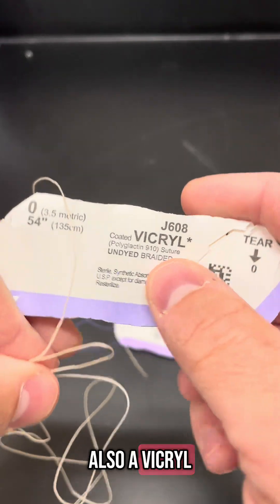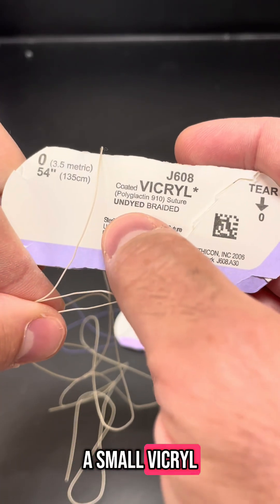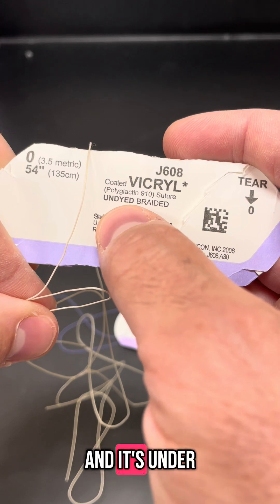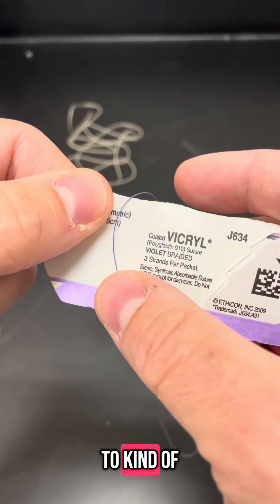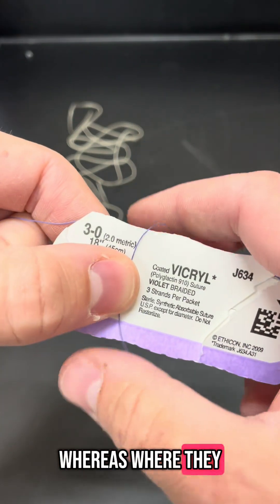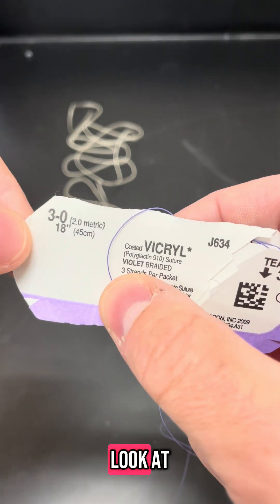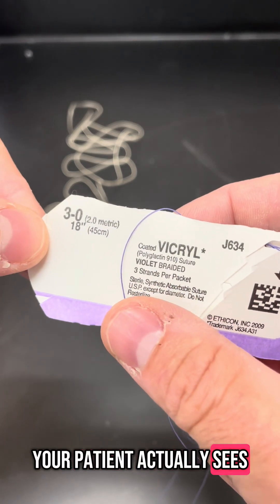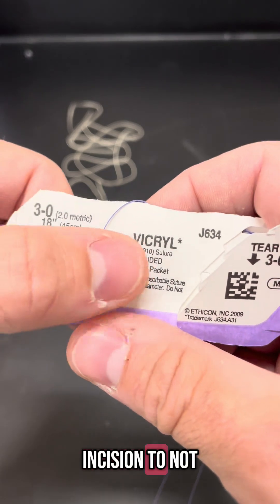Also a vikryl. This one's undyed, so it's white. If you're going to put a small vikryl up under the sub-Q and it's under the skin, you want this to be undyed because you don't want this purple to kind of shed off on the outer layer of the skin where they can see it. It's not going to be harmful, it's just going to be not as pleasant to look at. The thing that your patient actually sees of all the things you've done is your incision. You want your incision to not be turned purple.